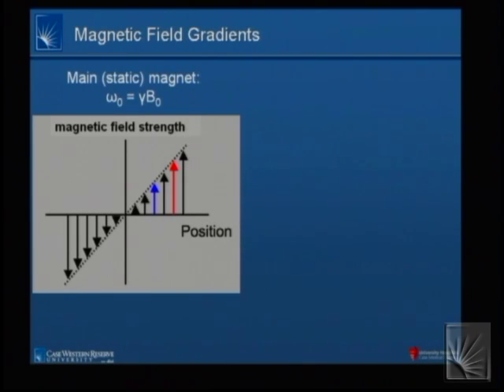So generating a signal is all well and good, but that's not imaging, right? So I said I have Dr. Leparo, I put him inside the magnet, I send out a pulse of RF energy, all the magnetization from his body tips over, I induce a voltage in a coil. That's not imaging. I need to figure out where that signal comes from, or alternatively, selectively excite one location over all others. The one thing we know is that the spins are only going to get tipped over if they're on resonance. If the frequency of the RF pulse is exactly the same as the frequency at which they're precessing about the field.